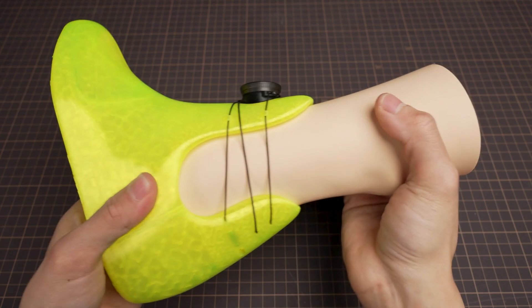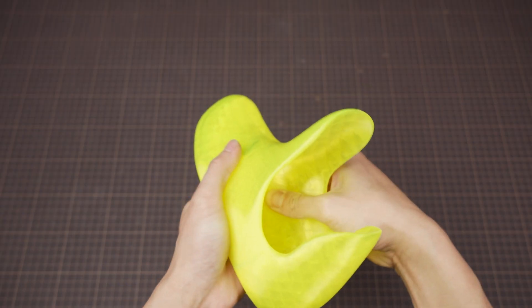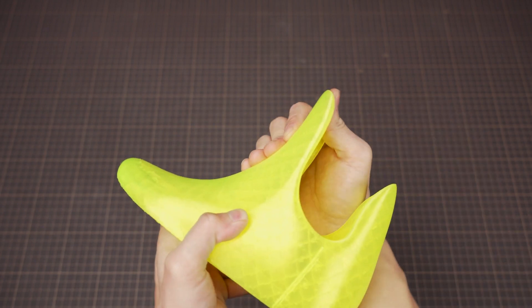But the problem is that even this prosthetic, printed with TPU material, has an inner surface that is still a little too hard and uncomfortable. And the supportive structure is not strong enough.